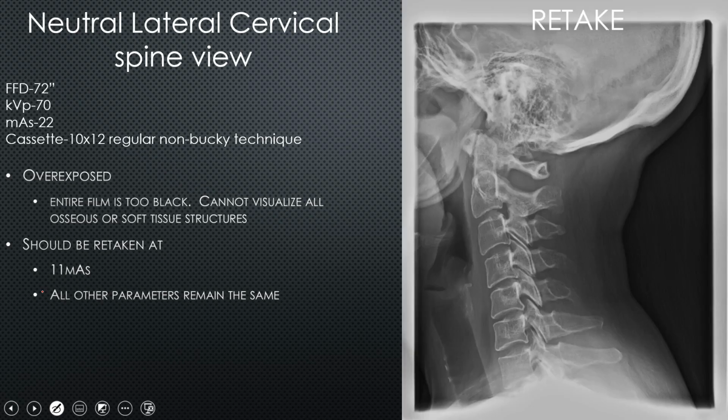And this is what it shows as a retake. So we can see, we can appreciate the vertebral segments, the posterior aspects of our vertebral segment. We can see the soft tissues, the posterior soft tissues, and even the anterior soft tissues and trachea and pharynx as well.